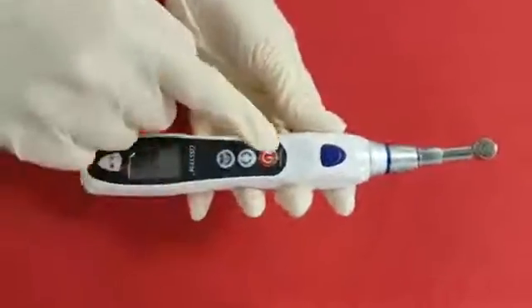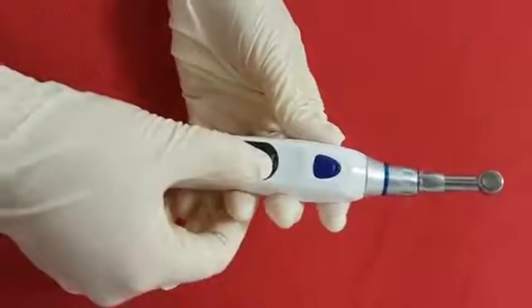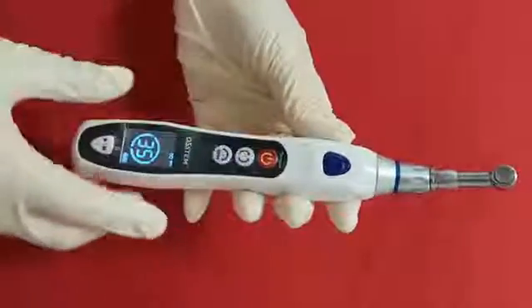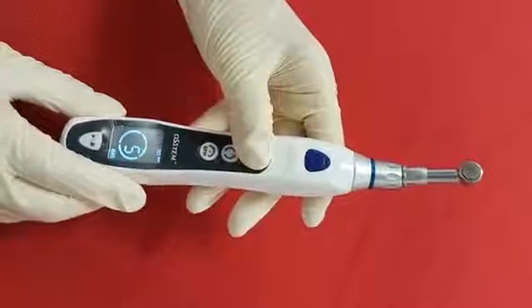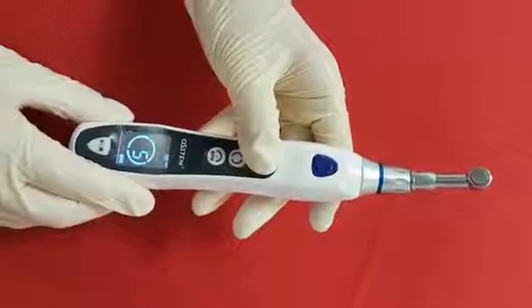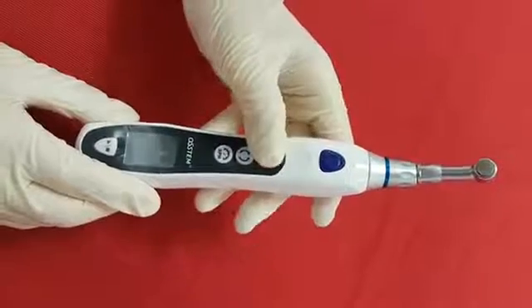Now let me show you the power button in the middle of the body. When you press it over 3 seconds, it will be on. Vice versa, you can turn it off by pressing it over 3 seconds again.